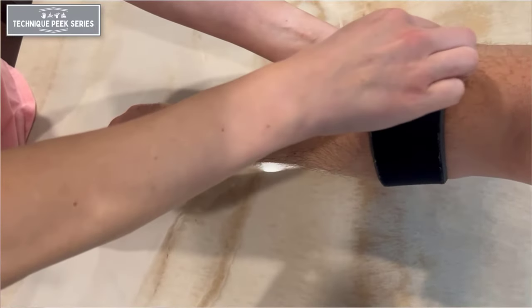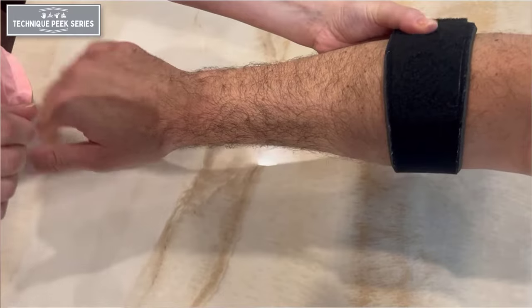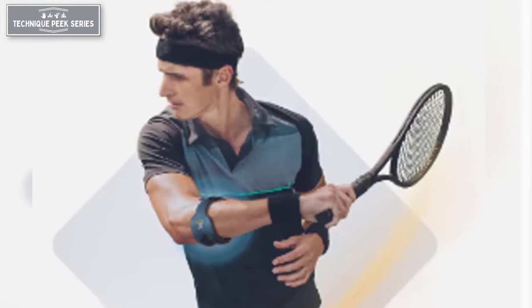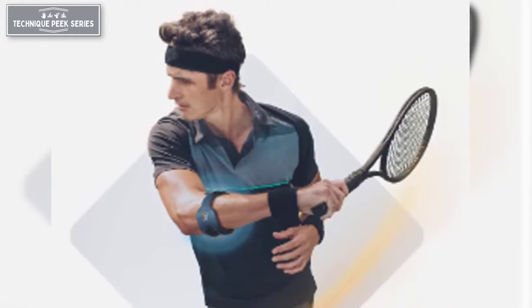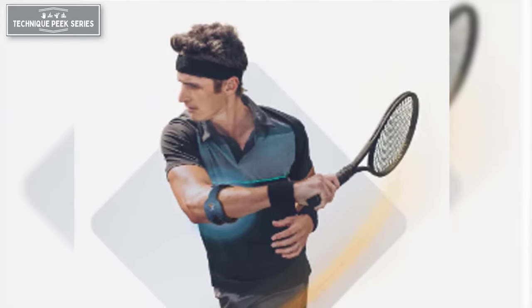Once fastened and the wrist is relaxed, the brace should feel secure but not tight and not leaving marks in the forearm when removed. With proper use, this brace can provide a counterforce to the irritated lateral epicondyle when using the wrist extensors actively.